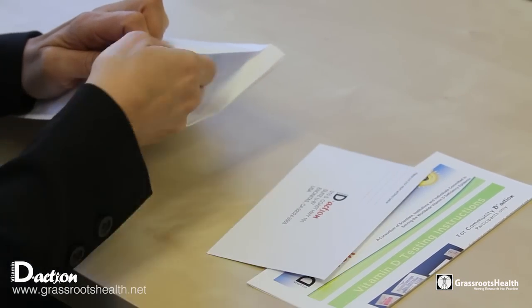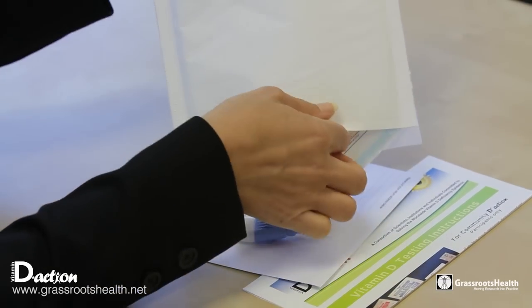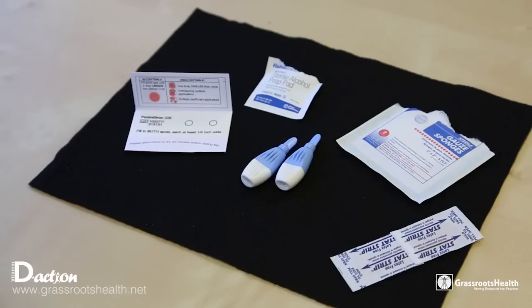The first thing you need to do from your kit is to have laid out all the pieces in this order. Notice the blood spot card on the left, then an alcohol swab, the two lancets, a gauze pad, and a band-aid.